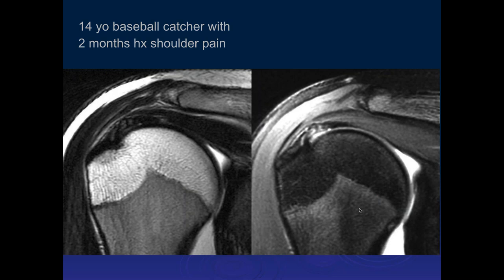On the coronal images, what did you see, Sahar? There is increased signal — I think there's moderate intersubstance partial thickness tearing of the supraspinatus.